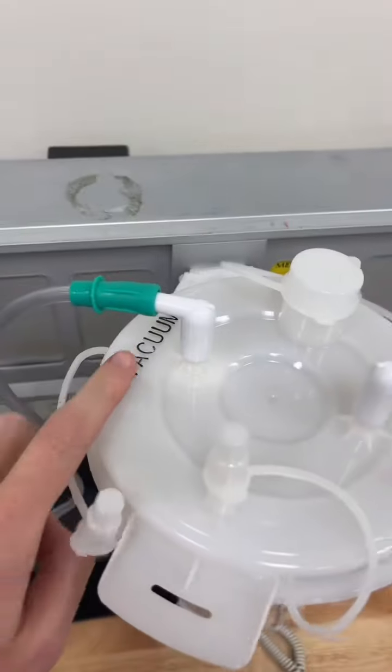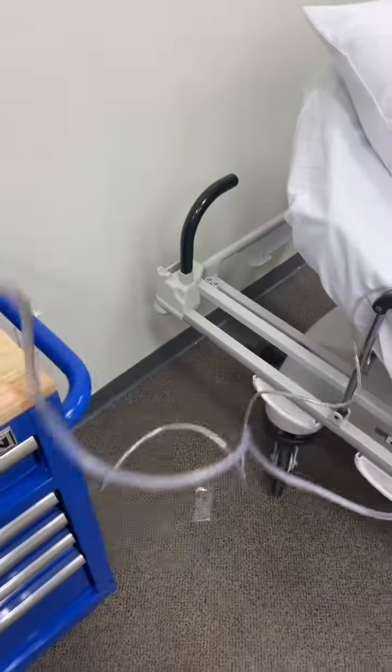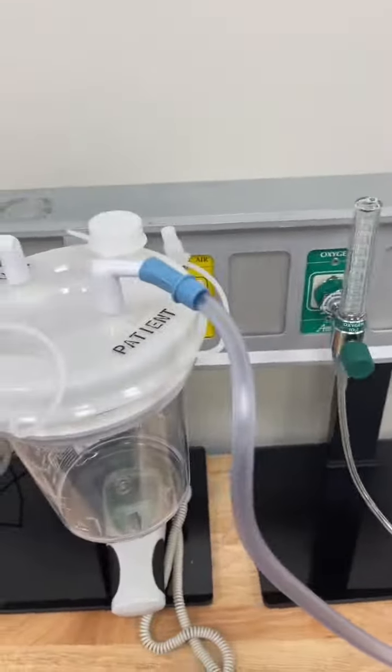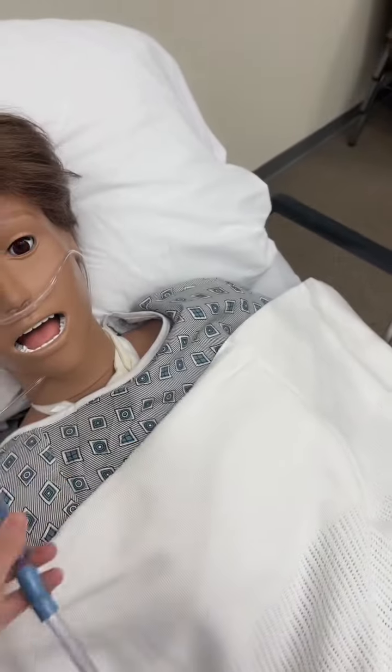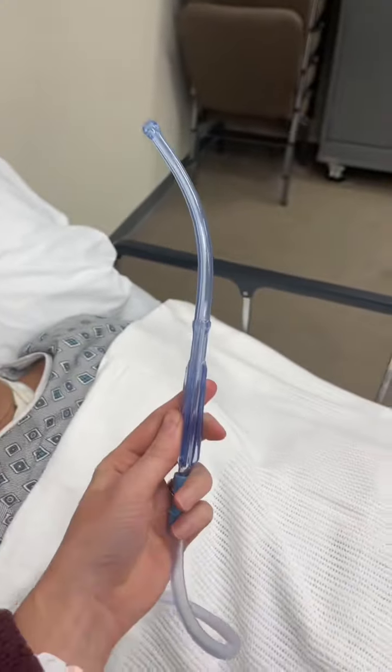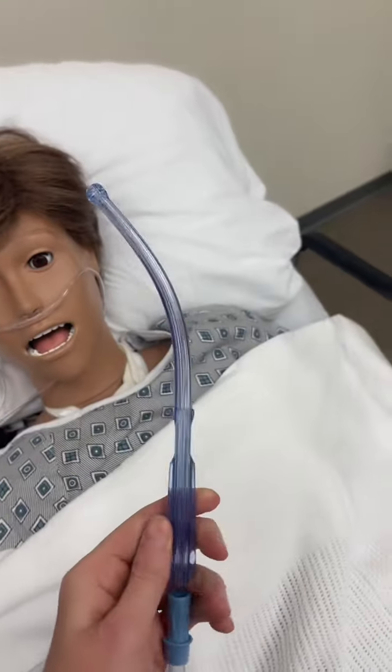Then we have up here, so the vacuum connects to the vacuum, which is what creates the suction. This is what goes to the patient. Okay, so here I have suction tubing that I have hooked up, and it goes to my patient with this, okay? And then this is like a yanker, whatever you call it. And then this is what you put in their mouth to suck out secretions, okay?